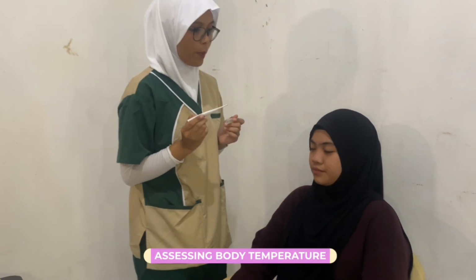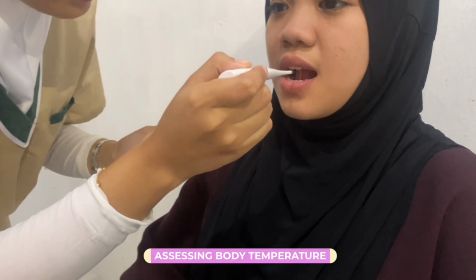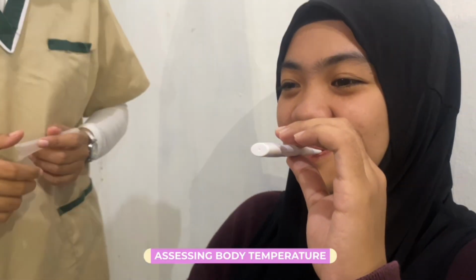Ma'am, can you please open your mouth? I will insert the tip na. Can you close your mouth, ma'am, and then hold the thermometer? Thank you.